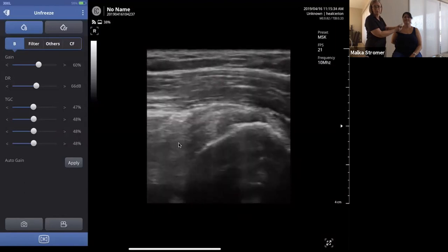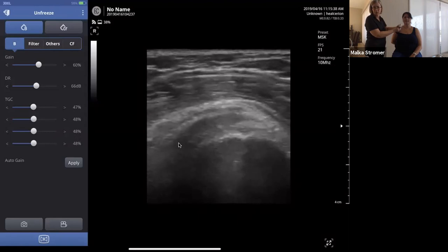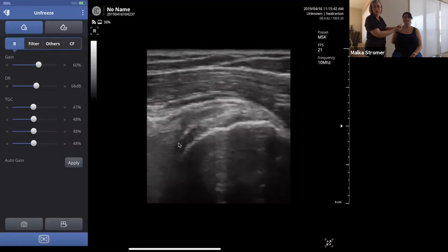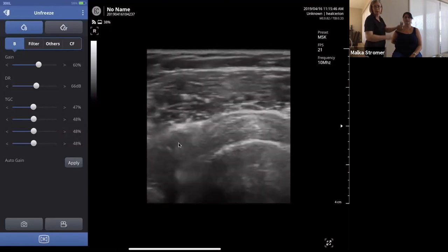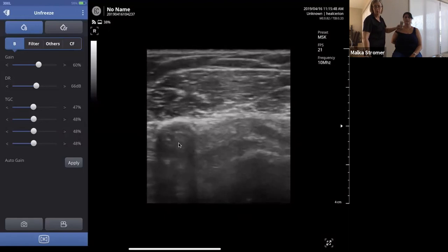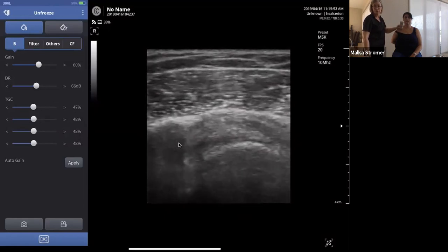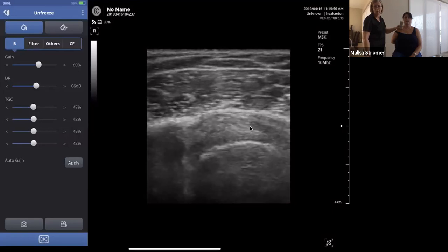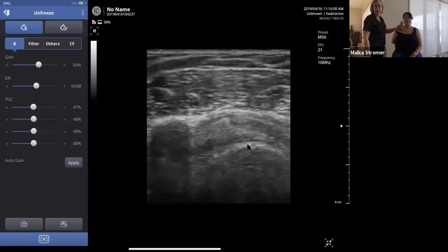I'm going to scan through this. Keeping in mind, the beam is only the size of a credit card. So you want to go the entire width of the tendon. Then I will rotate this 90 degrees. We're now in a short axis view. The long view looks like a bird's beak. The short axis view looks more like, I call it a rainbow, or if you're a guy, it's a radial tire.